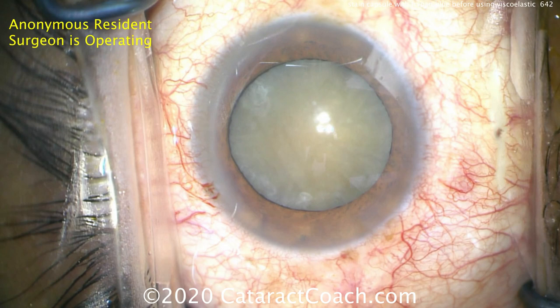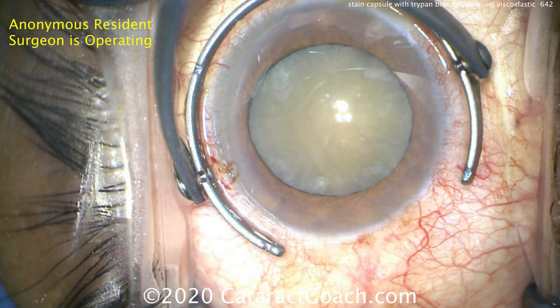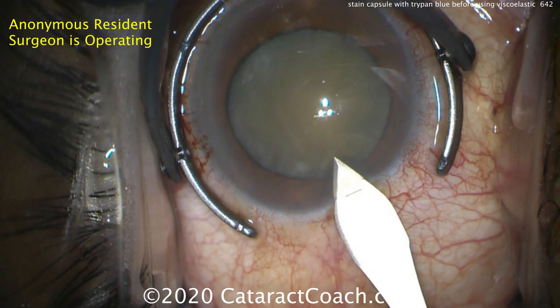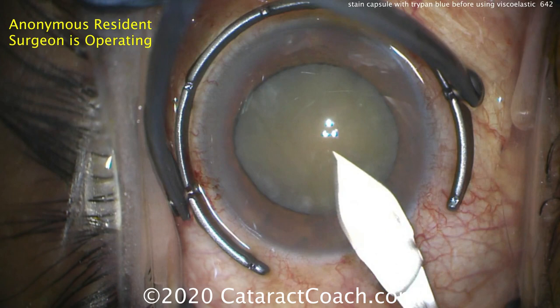Now time for the phaco incision. Here comes the fixation ring and the keratome, and a temporal incision is going to be made. This looks like a pretty good position — I like the architecture, it looks pretty balanced. Tunnel length is good, just about ready to enter the anterior chamber. I'll take it. I like the incision.